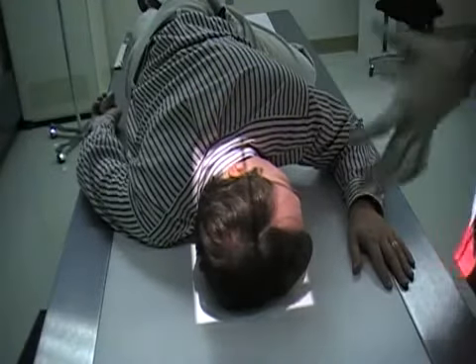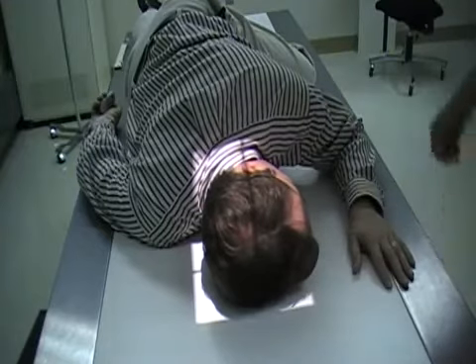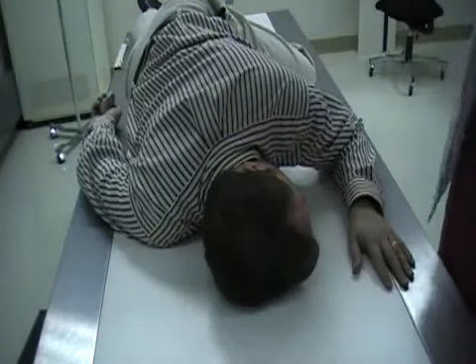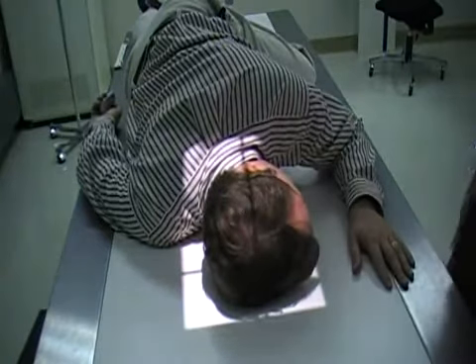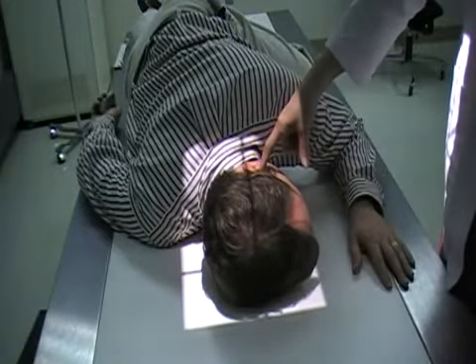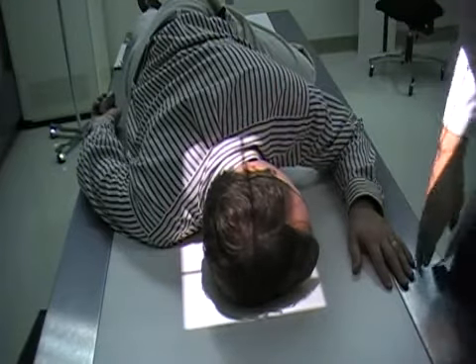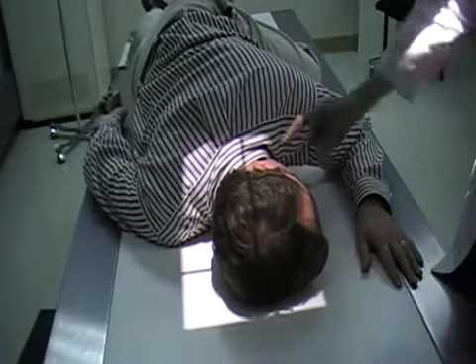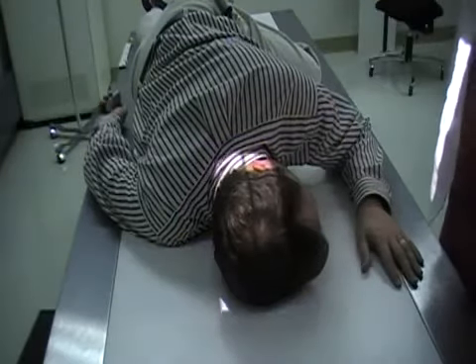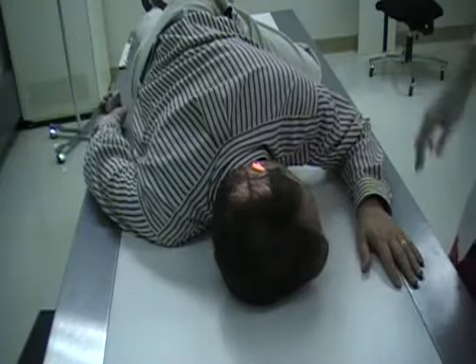Then you want to turn the face down approximately 15 degrees. So once you have those two 15-degree angles taken care of, your central ray is going to enter two inches above the EAM and two inches behind the EAM. This is our mastoid for the right side — you can just collimate down to that.